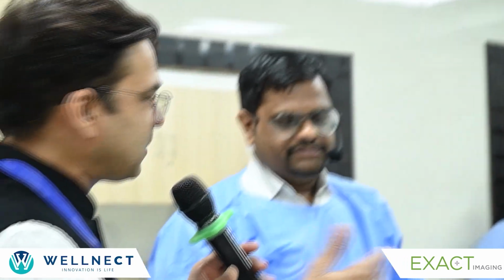So I think Gupta sir, we can have your insight as you are there. We already had, quite some years back, targeted plus systematic biopsy, and there was a good amount of evidence that when we do targeted alone, there is a high probability that we can still miss the result. So doing only targeted biopsy is not the standard of care as of now, as per our understanding, sir.